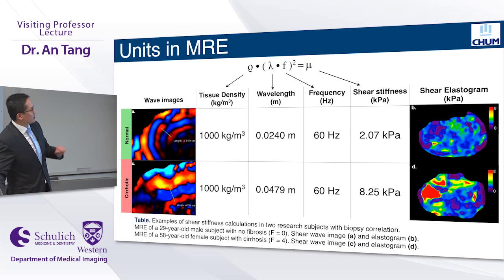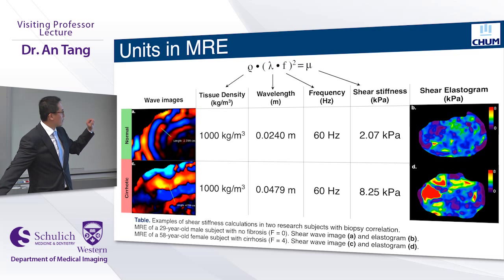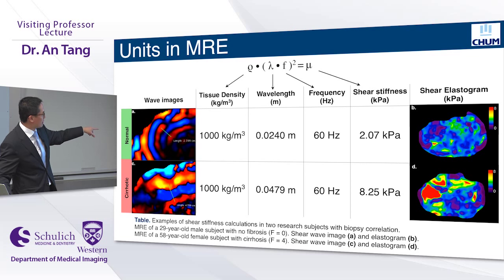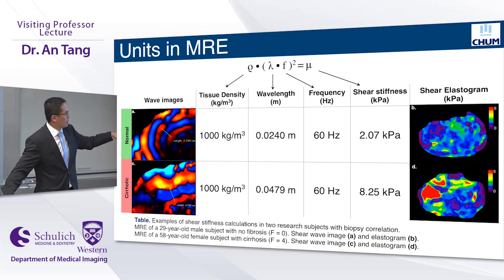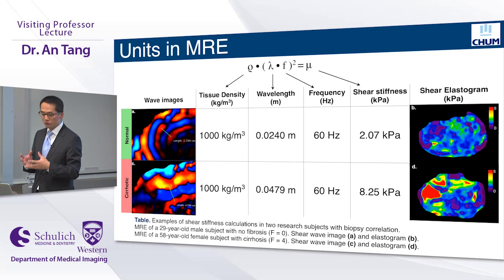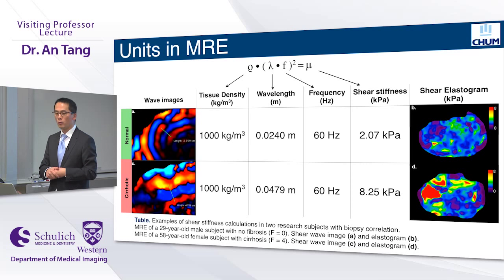Here are some images. On the top row, a patient with a normal soft liver — I've manually measured the wavelength between two red peaks. At the same scale in a cirrhotic patient, the wavelength is very elongated. Based on assumptions about tissue density, measurement of wavelength, and known frequency, we can calculate the shear stiffness. On the right are elastograms: a normal soft liver on top and a stiff cirrhotic liver on the bottom.